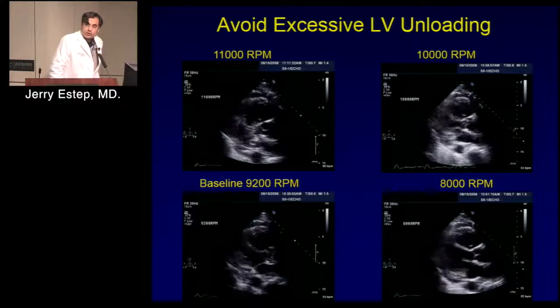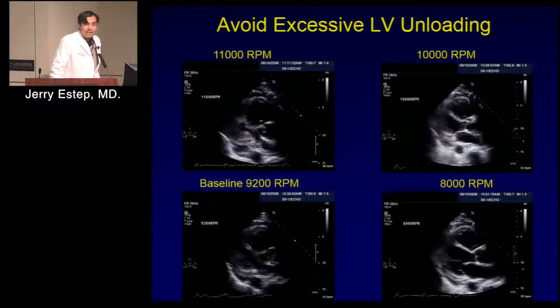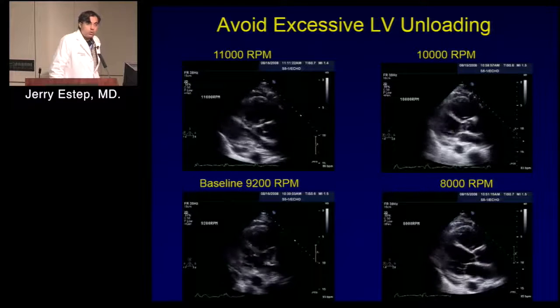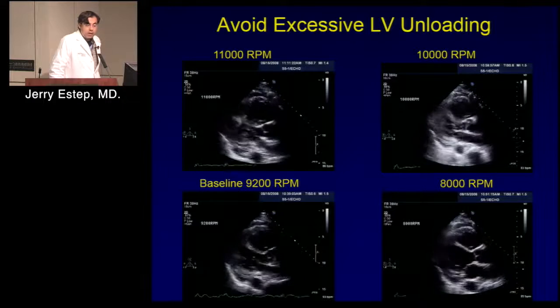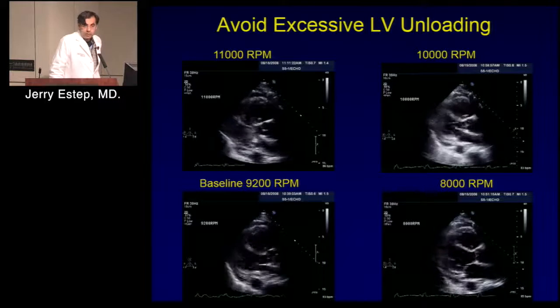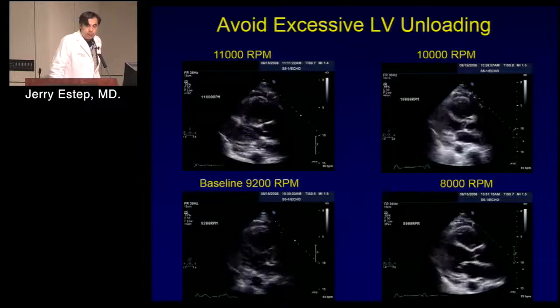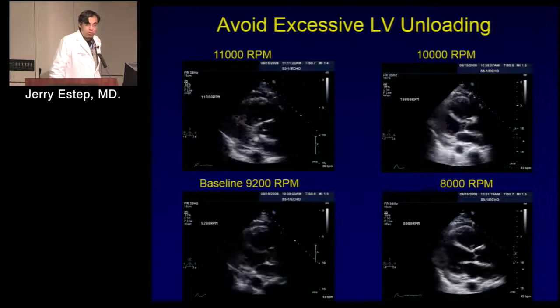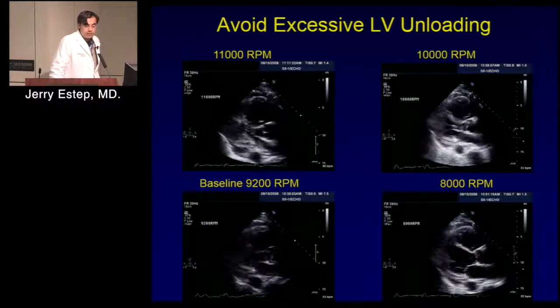Very, very good question. So what we've transitioned to is doing speed optimization along with hemodynamics in the cath lab to best understand unloading and over-unloading using echo, and we're setting the speed in real time. For those patients, it's our protocol to do it in and around 4 weeks post-implant, and so we're making that decision in real time.